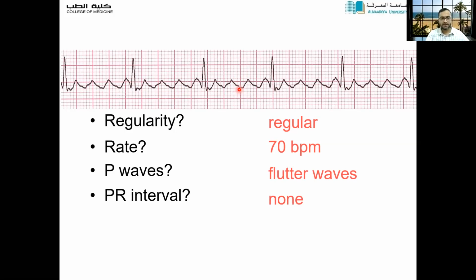And this is another example of supraventricular tachycardia I have given, because if you count the number of P waves here, the atrial rate, the number of P waves coming per minute, will go above 250 beats per minute. Ventricular rate is normal because not all the P waves are conducted to the ventricle. Here the atrial depolarization rate is very high, about 250 beats per minute, but the AV node cannot conduct all these impulses to the ventricle.